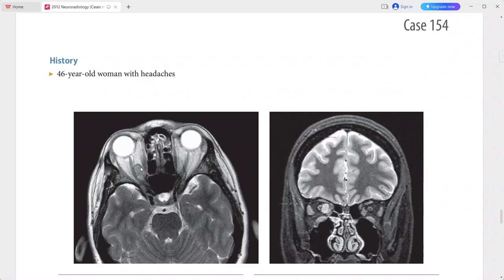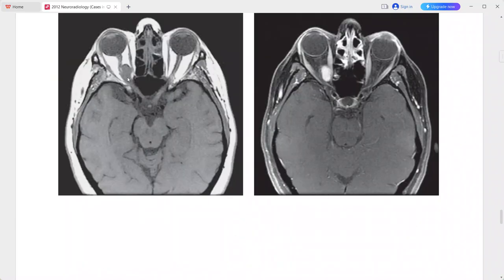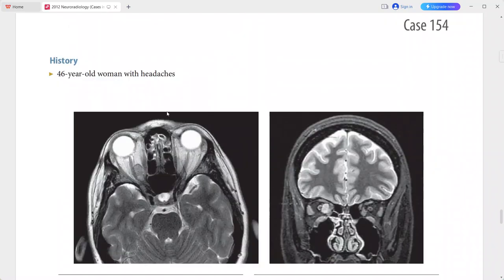The mass is isointense on T1-weighted images and shows homogeneous enhancement after IV contrast administration.